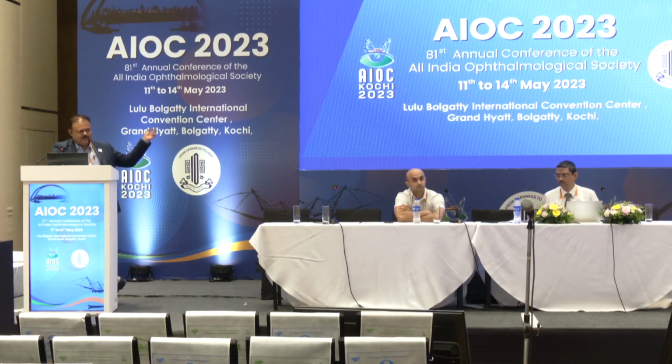Yeah, I showed it was a through and through. It was almost a 6 to 9 o'clock rupture. Yeah, it was an iatrogenic break, and there was 360-degree choroidal hemorrhage. Yes, I could have done the laser only to that area if I was pretty much sure that that is the area, because at that time it was very difficult to identify the exact location of the break. Obviously, we had done a cryo over there, but I didn't take a chance. I did a 360. There's no harm if it's a mild burn.